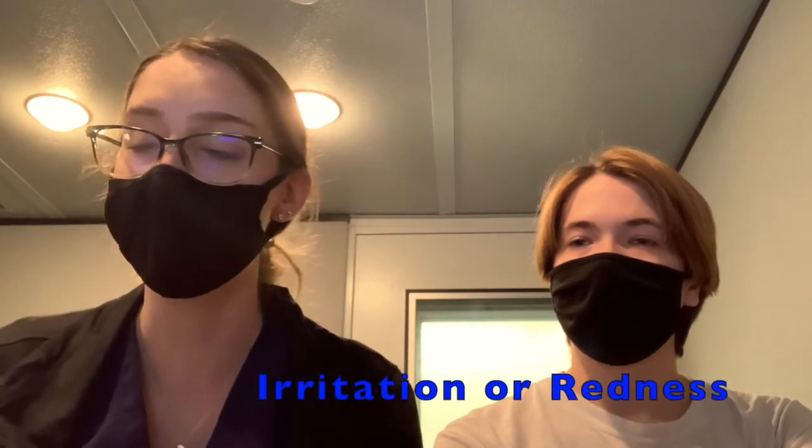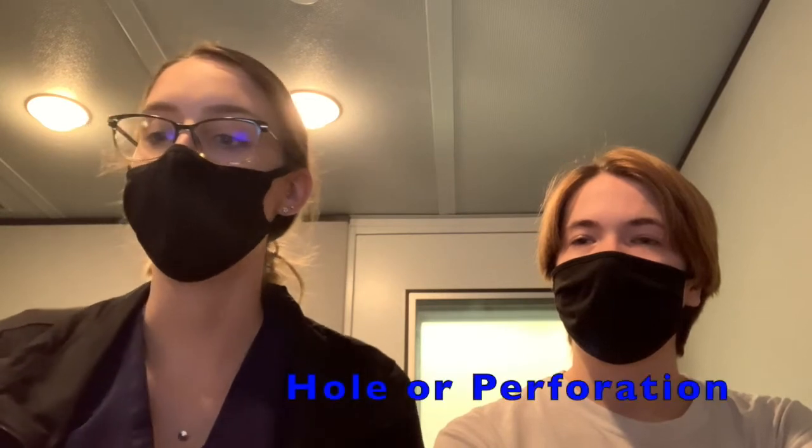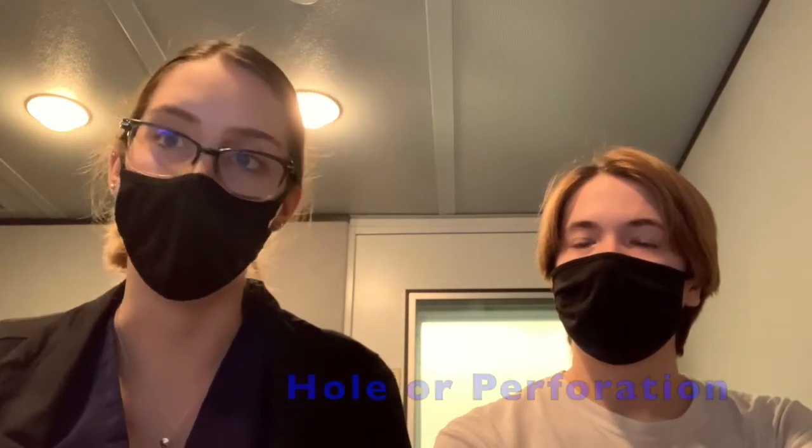When you're looking at the eardrum, you're looking to see if there's any irritation or redness, if you see any white or splotchiness, or if you see any hole or perforation within the ear. That would be abnormal. If there are any problems found, typically you would want to refer the client to an ENT for further testing and evaluation. Great. So now I'll show you how to do otoscopy.